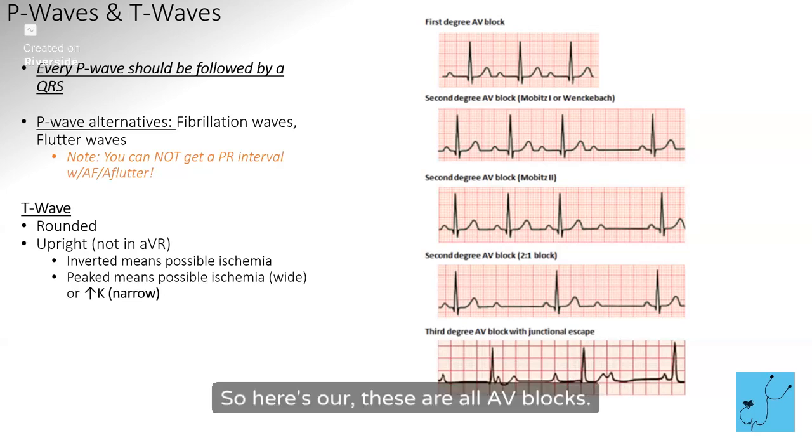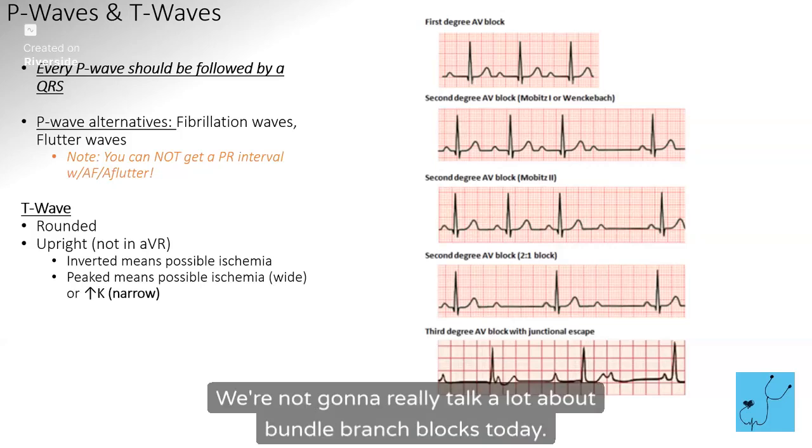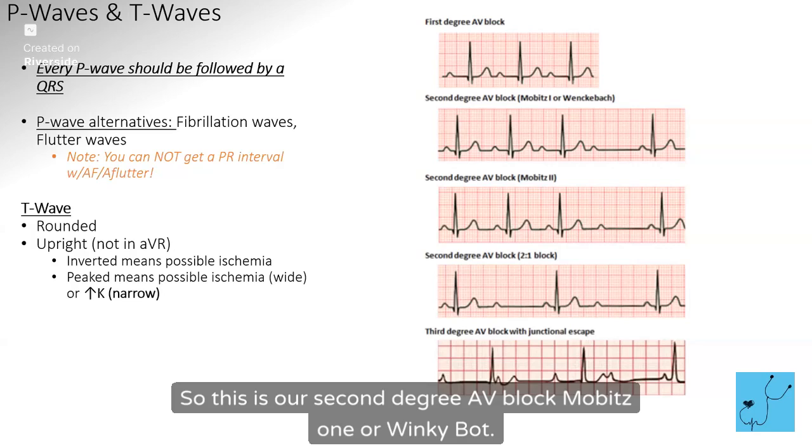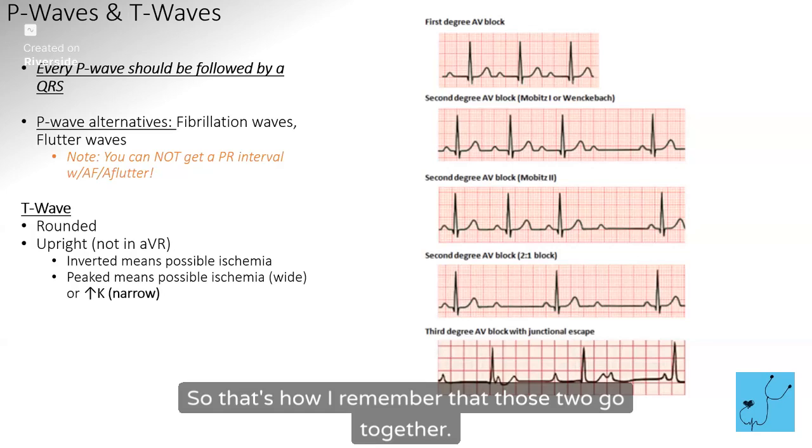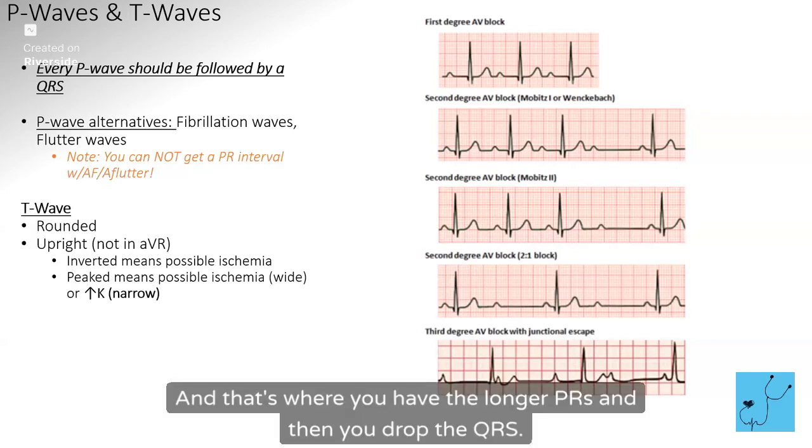Okay, so these are all AV blocks. We're not going to really talk a lot about bundle branch blocks today. This is our second degree AV block, Mobitz 1 or Wenckebach. I always remember that it's Mobitz 1 or Wenckebach because you wink with one eye. That's how I remember that those two go together. And that's where you have the longer PRs and then you drop a QRS.